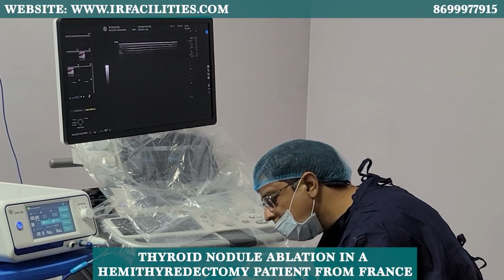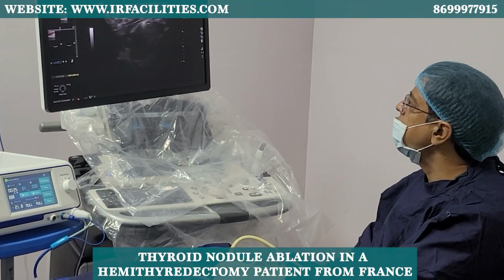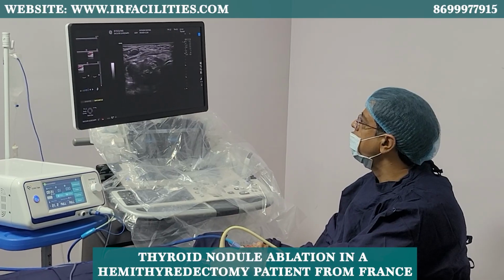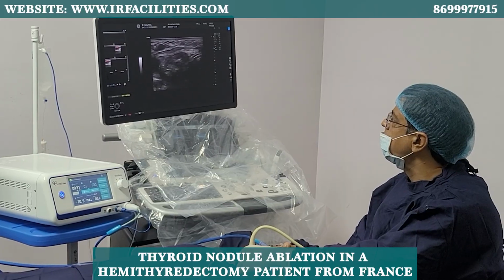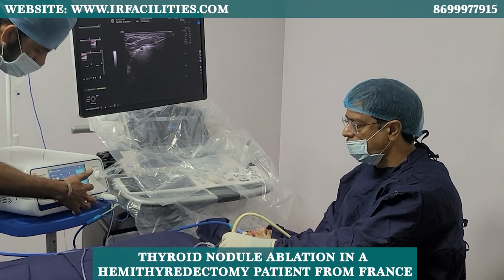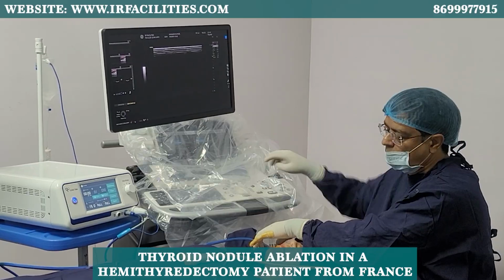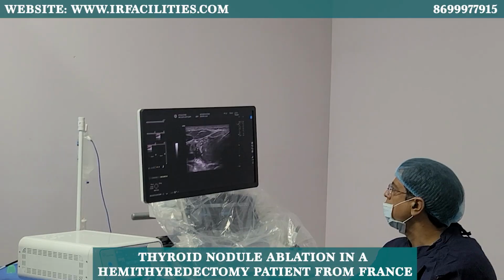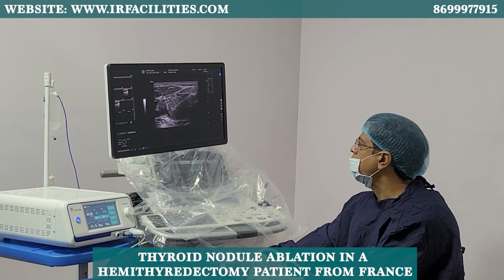Pain? It's near the surface. It can cause pain. This particular lesion was close to the surface, so surface is painful. Okay. If you get pain, just tell me. I'll reduce the wattage.